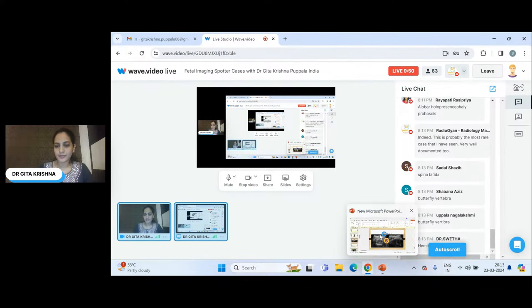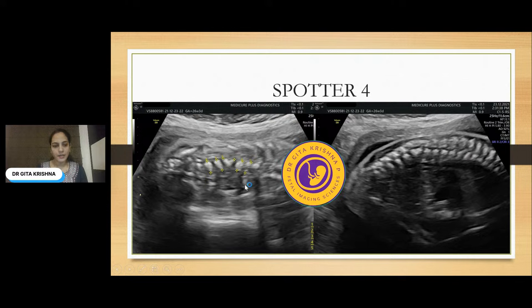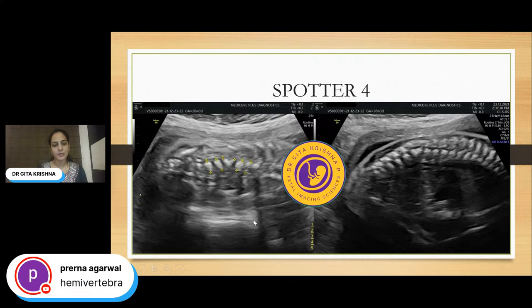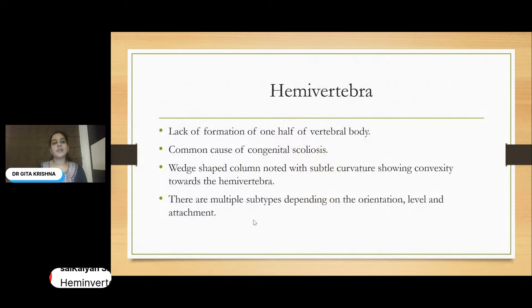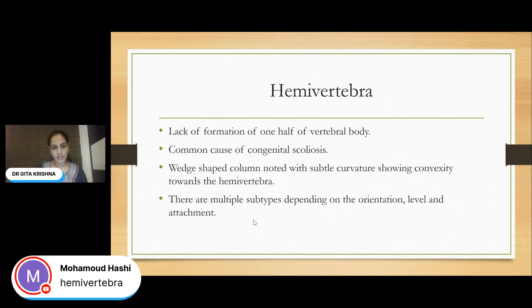Yes, it is hemivertebra. As this is the sagittal image, we can see the continuity of the skin line, but a focal kyphotic defect is noted, caused by the hemivertebra. The key here is to screen the spine in coronal view, where the alignment is very subtle, causing scoliosis towards the anterior aspect due to this hemivertebra. Hemivertebra is due to lack of formation of one half of the vertebral body, which is the most common cause of congenital scoliosis. The wedge-shaped column with subtle curvature showing convexity towards the hemivertebra is the key. There are multiple subtypes depending upon orientation, level, and attachment.